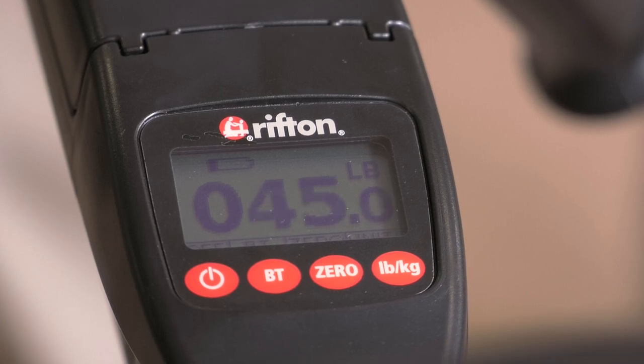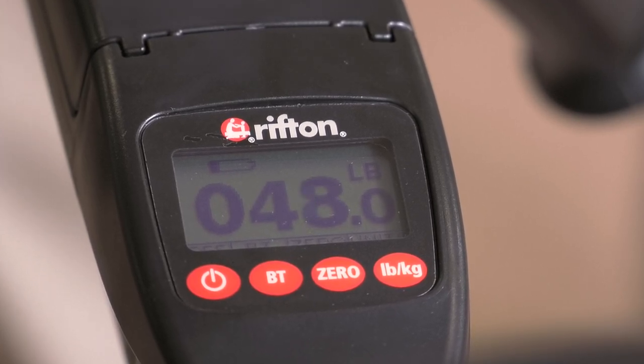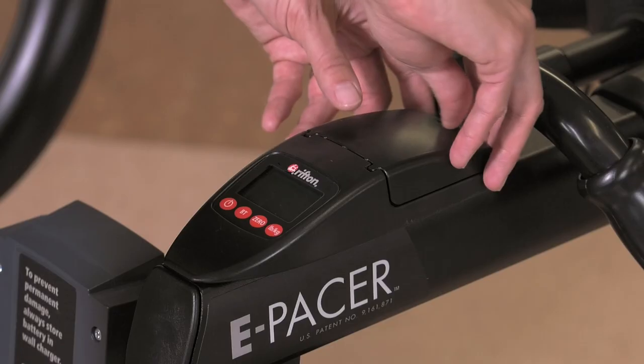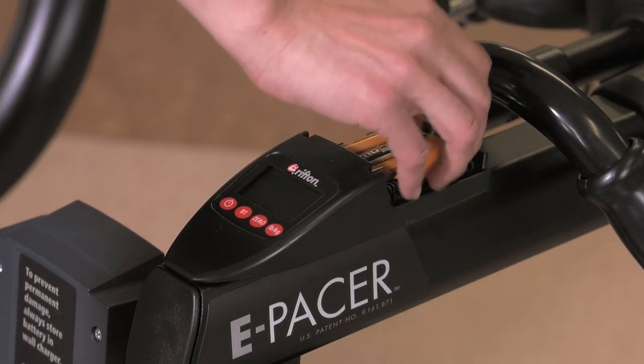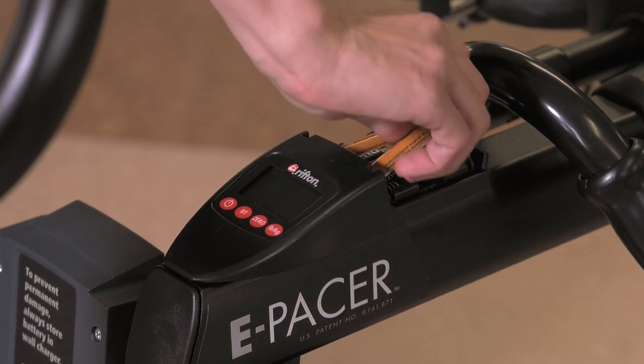The scale will tell you how much weight is being taken off a patient's feet. The scale has a separate set of batteries. Replacement AA batteries are stocked in each nursing storage area.